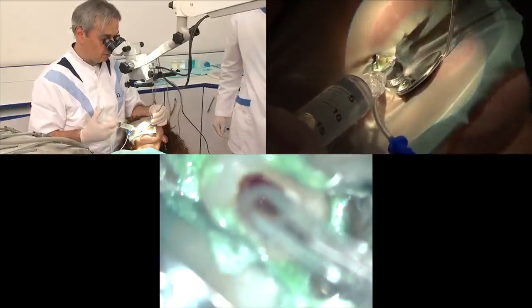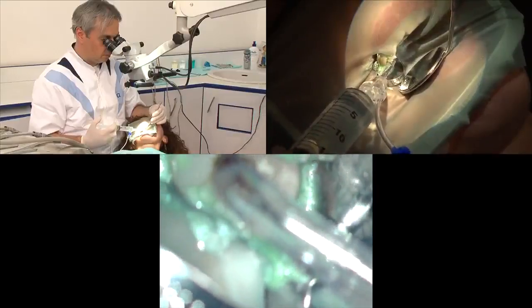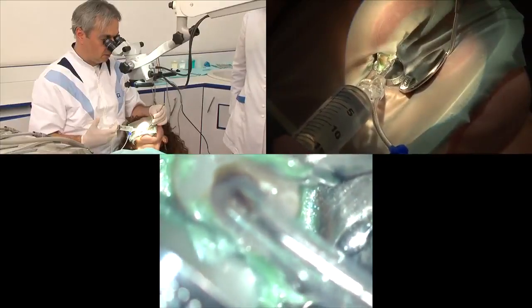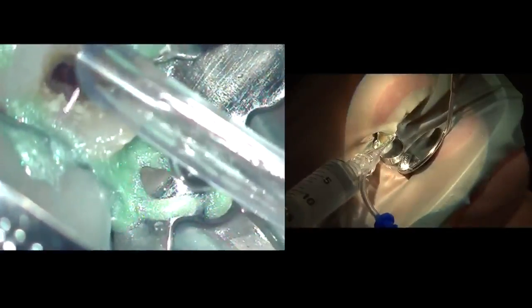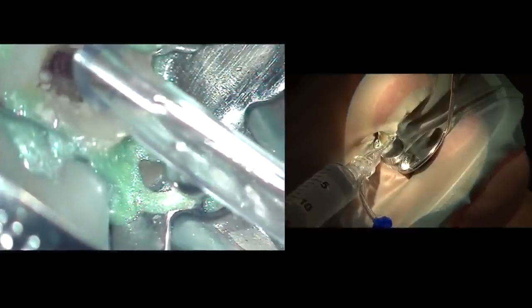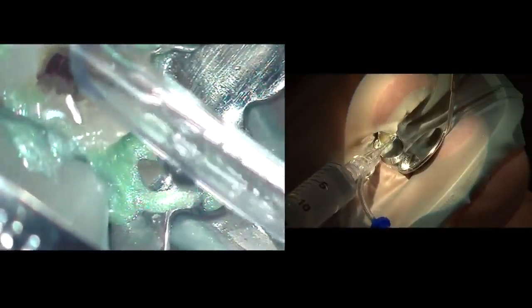The first step after opening the access cavity and finding the roots is to take the INDOVAC and wash out all the debris from the main access cavity. The tip of the master delivery unit must be angulated towards the walls of the access cavity. You can see the flow of irrigants coming out — sodium hypochlorite is being delivered and then taken out.